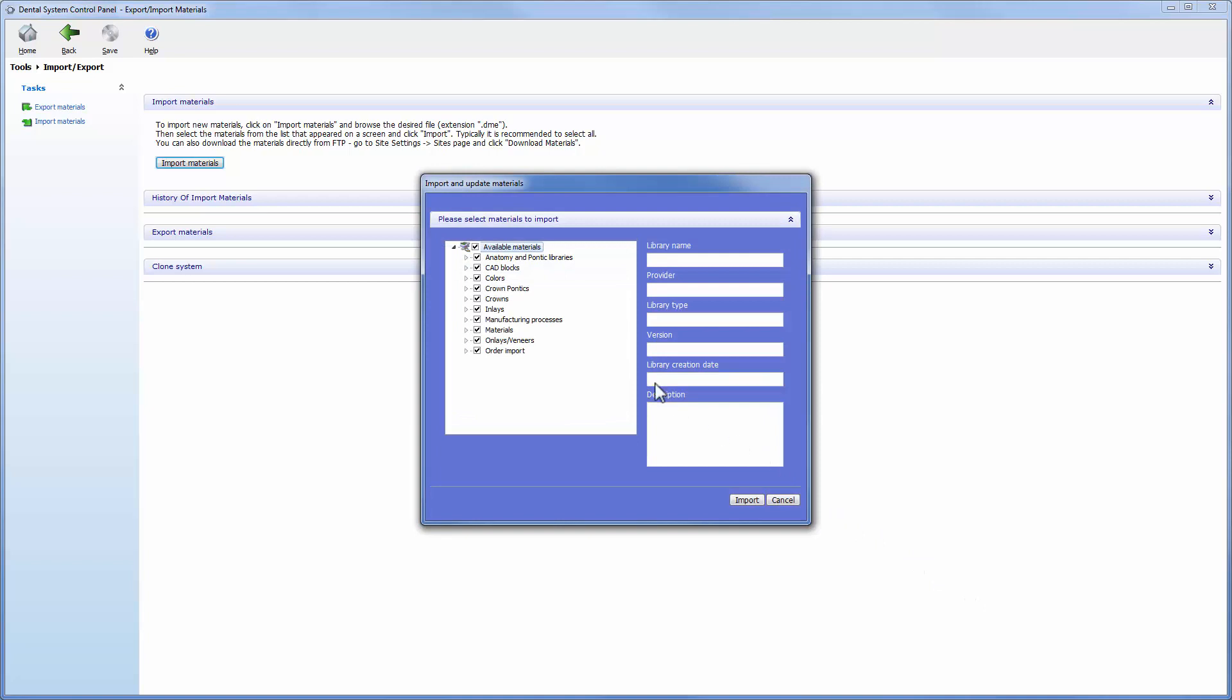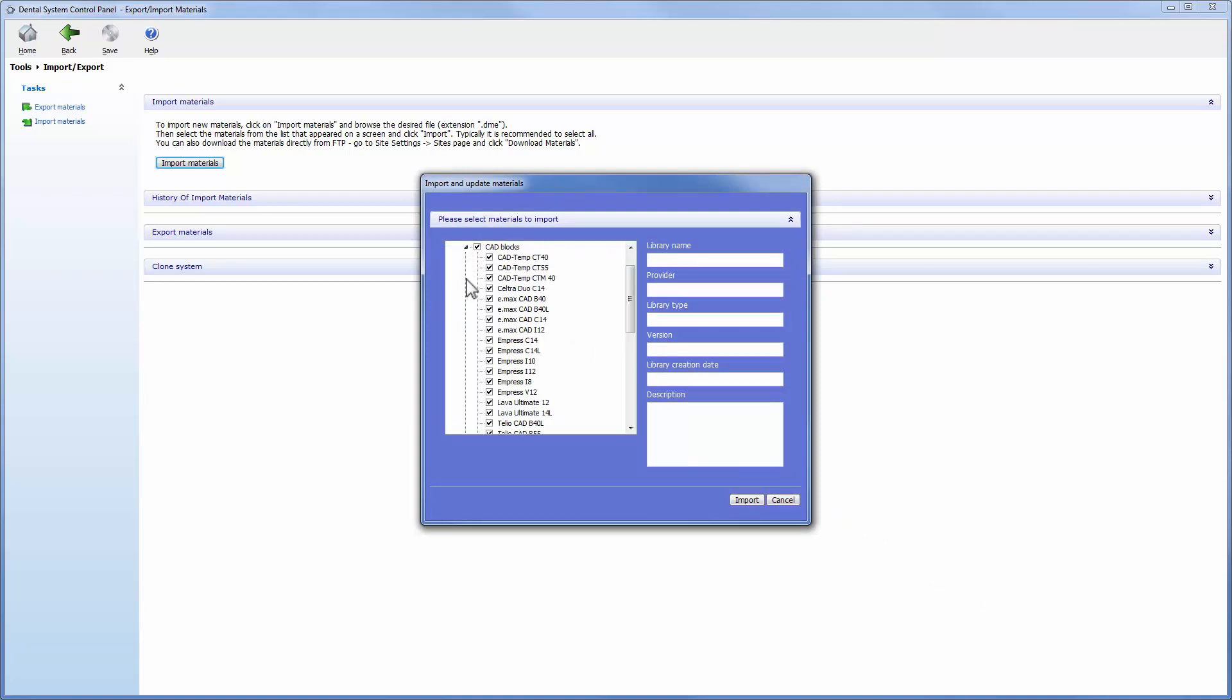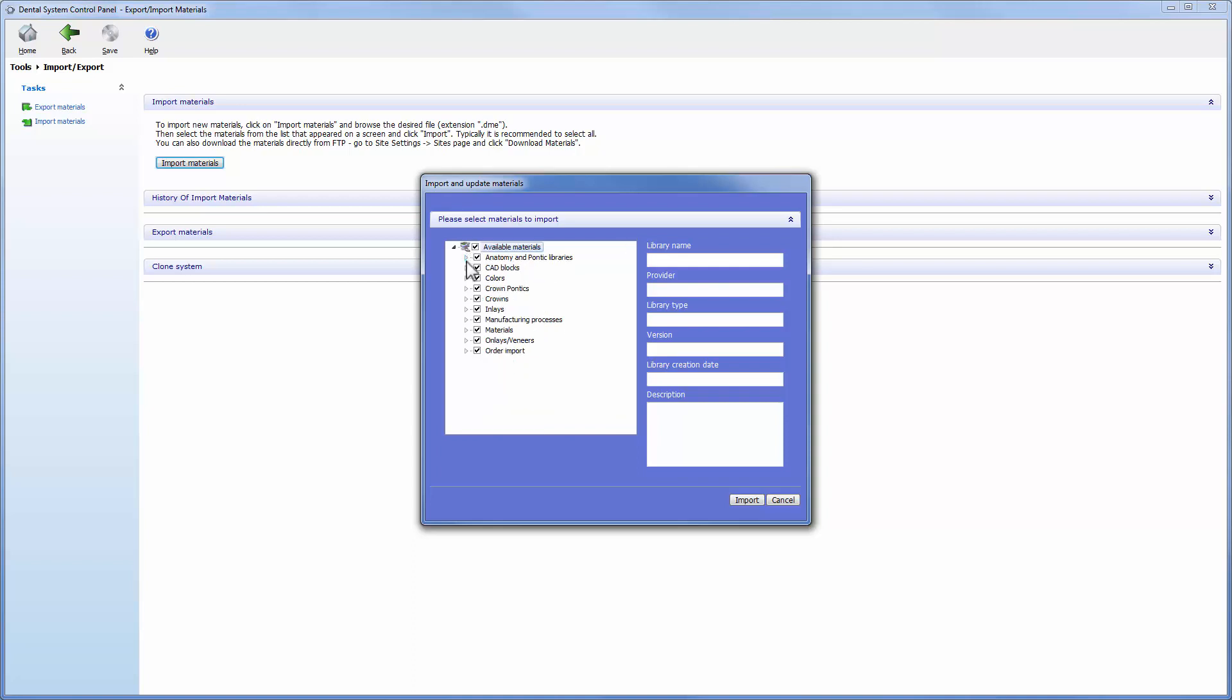You have the possibility to deselect certain material settings from being imported if desired. You can do this by unchecking the checkbox in front of the specific settings.